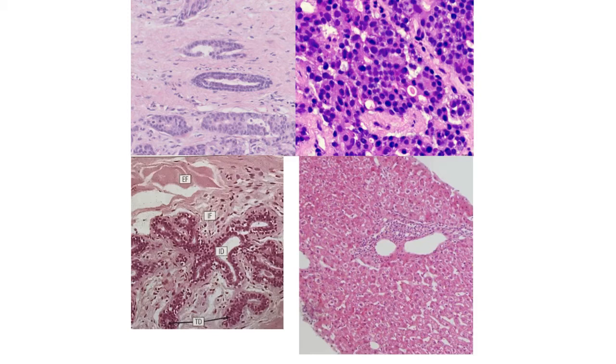Now we see normal liver core biopsy. What we see are lots of tightly packed hepatocytes, which is what you would expect to see in a liver biopsy from a patient that's not showing any disease. And the area here that's sort of seen as a clearing, this is the terminal hepatic venule.